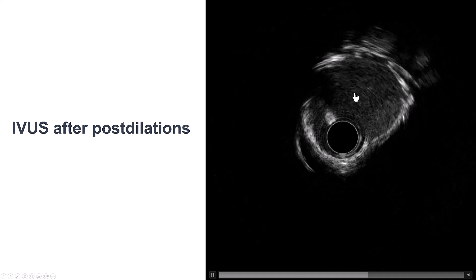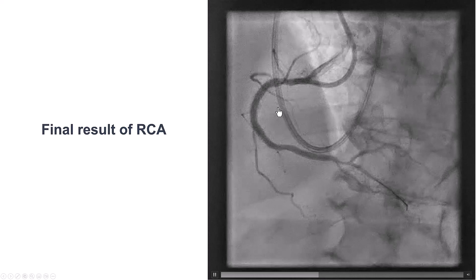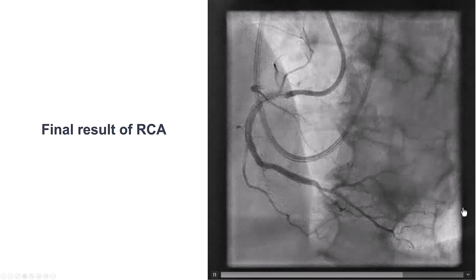We decided to continue with left main. Sometimes, if the right coronary intervention is complicated and we have to give a large amount of contrast and or radiation, if the patient becomes unstable, then we often will stop and stage the procedure for the left main. But in this case, the patient was doing fine, so we decided to move on.